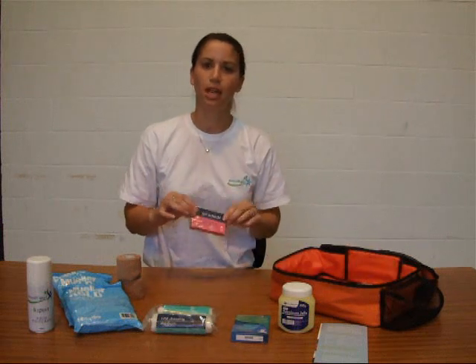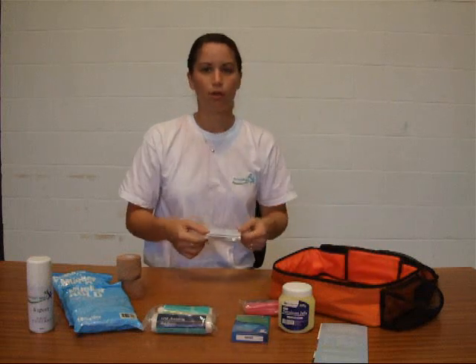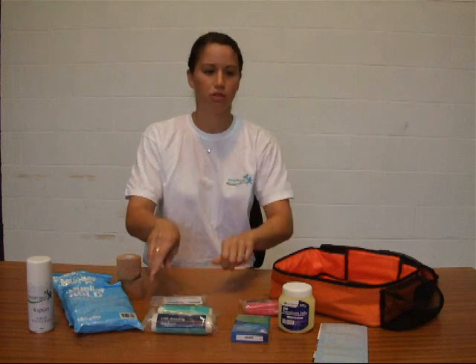There's a blanket for anybody that's injured laying on the pitch — great to keep them warm. Alcohol-free cleansing wipes that shouldn't sting when you apply them — just mop up any wounds before you put a dressing pad on.